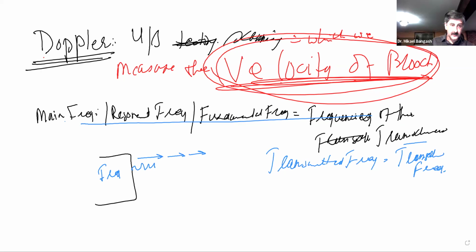Now when this sound wave hits blood, it is going to reflect back.